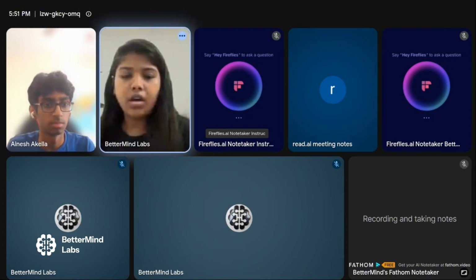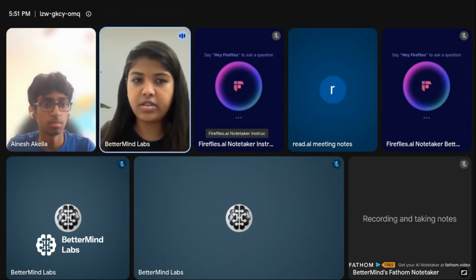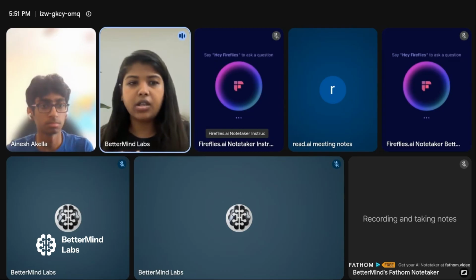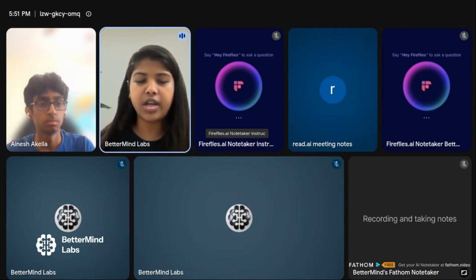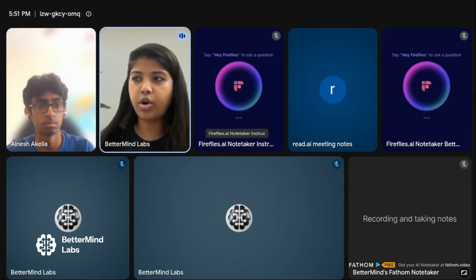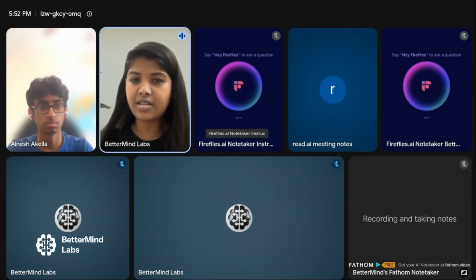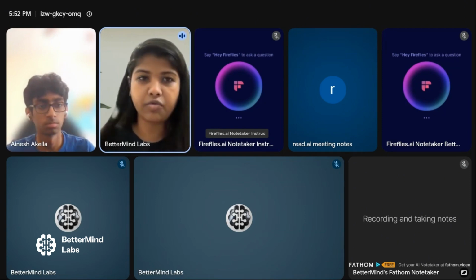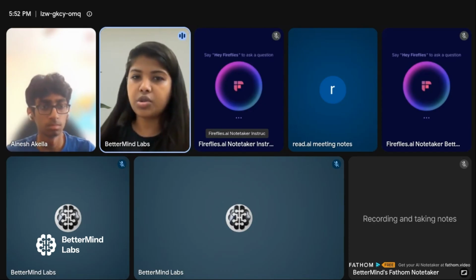Okay, got it. There were some really good features. I mean, the zoom in feature, firstly, that was really good. And the assistant part, the chatbot, you can convert it into something related to a voice assistant so that somebody who is in a hurry or has a lot of reports to scan, that person would already have a lot of workload. So it would be better if you could give it a voice assistant. He'll just speak out the reasons that he feels this report might be fake or forged. That will save a lot of time and make the product user friendly and convenient as well.